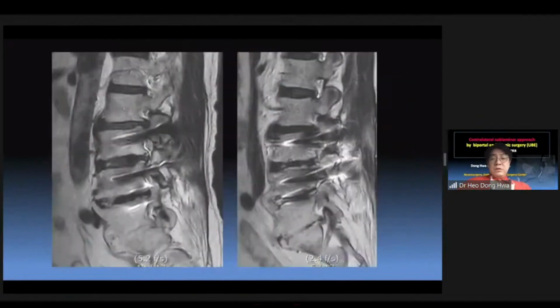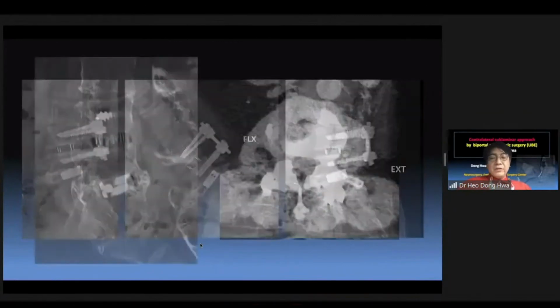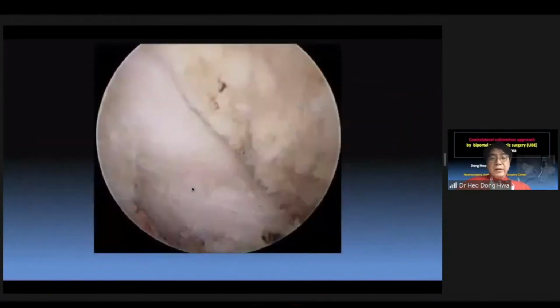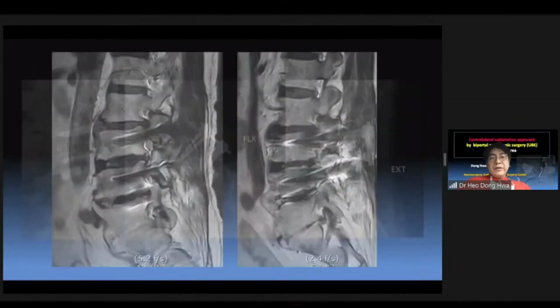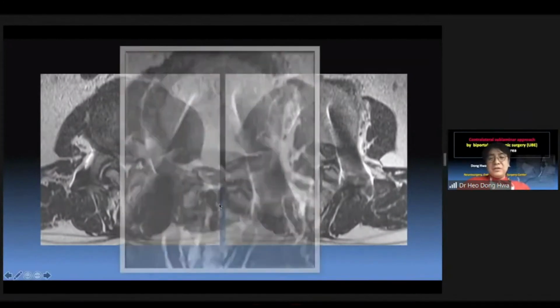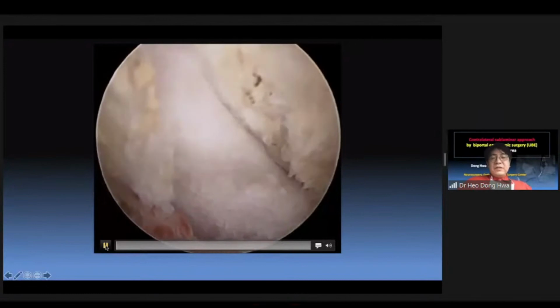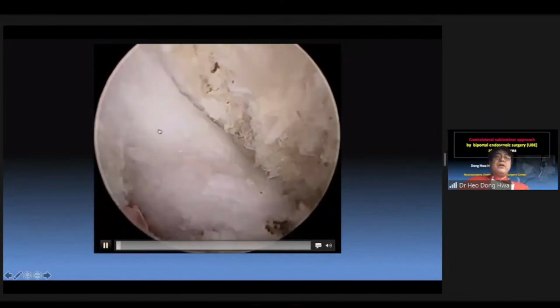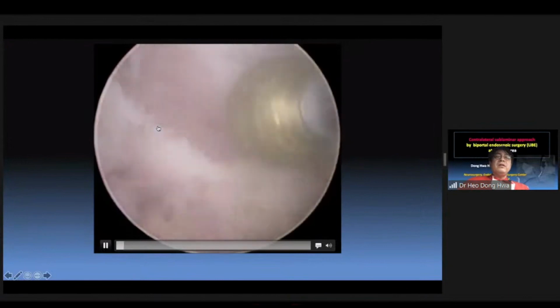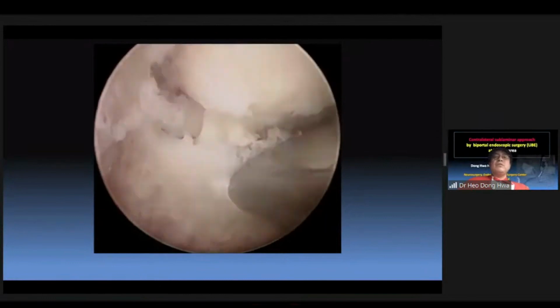This patient received fusion surgery 2 times. He did not want fusion surgery again. So, my decision, given the bilateral disc herniations as well as the stenosis, is unilateral approach, bilateral discectomy, left side approach. You can see the L2 lamina. This approach is very familiar for the biportal endoscopic surgeon or the PSLD surgeon.